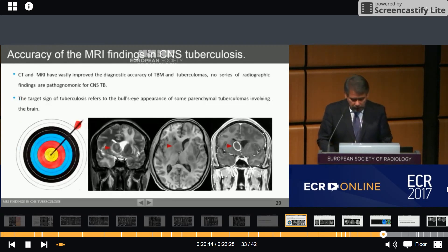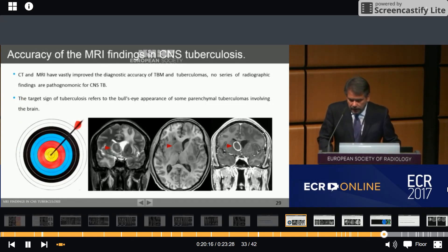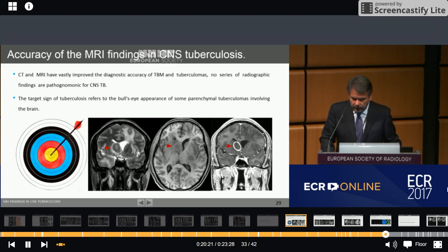The accuracy of MRI findings in CNS tuberculosis makes the diagnosis of intracranial tuberculosis essential for rapid treatment. The target sign of tuberculosis refers to the bull's-eye appearance of some parenchymal tuberculomas involved in the brain.